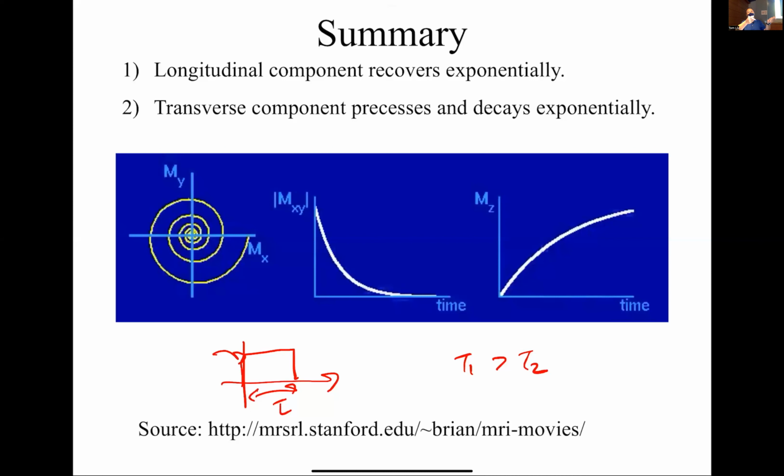So if someone tries to get you off balance very slowly, they're not even able to perturb you because you're always adjusting. So it's really the difference in the T1. If the T1 is very short, that means they can recover very quickly. And if you're too slow, you will never even be able to get them off equilibrium. All right. That's a good question. Anything else?